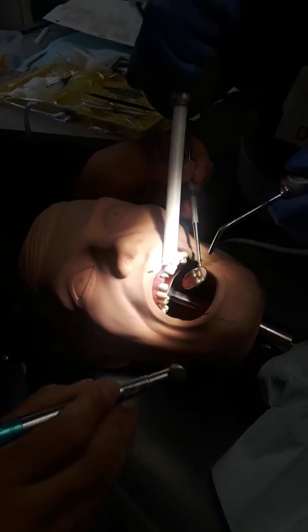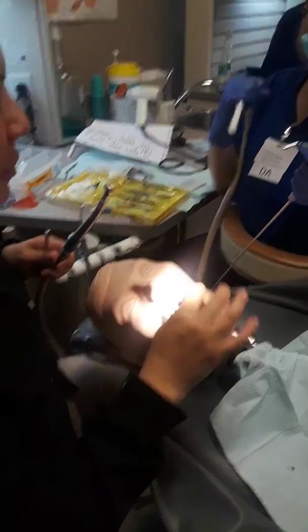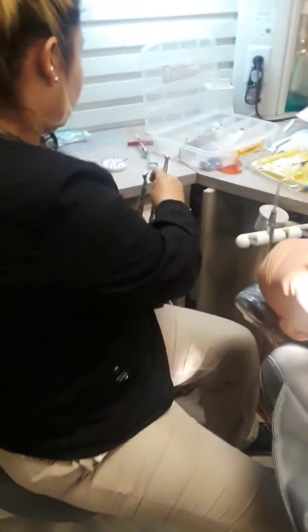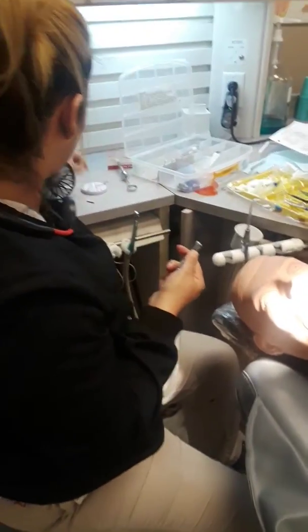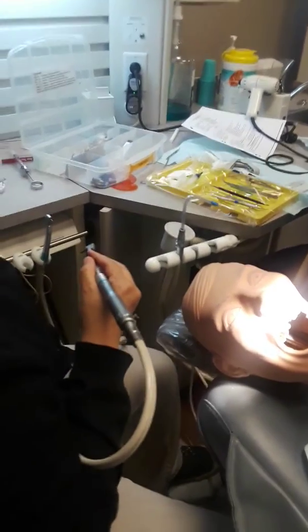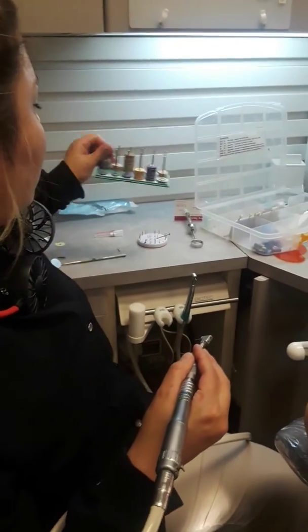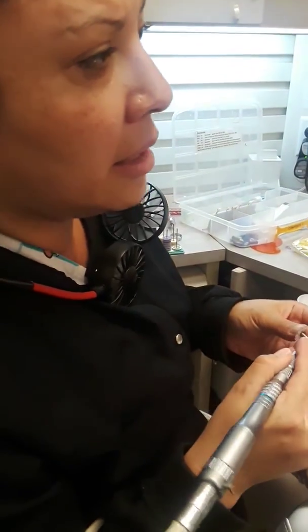The finishing burr kind of etched the surface again so it's rough — I'm just going to finish it with a disc.